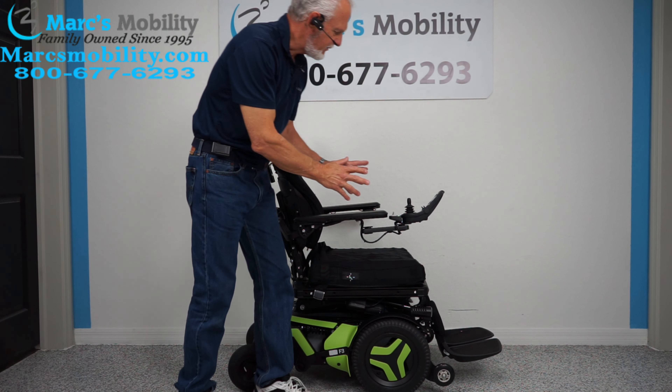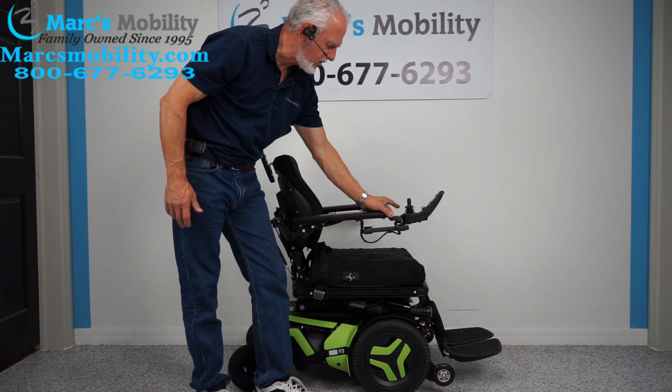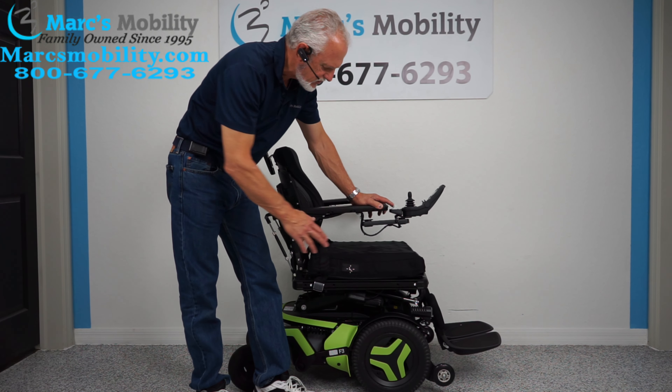All the functions on this chair can be worked through the joystick or through the switch box. I like to use the switch box back here — it's quicker for me. So if you push the first button forward, it's your seat lift.